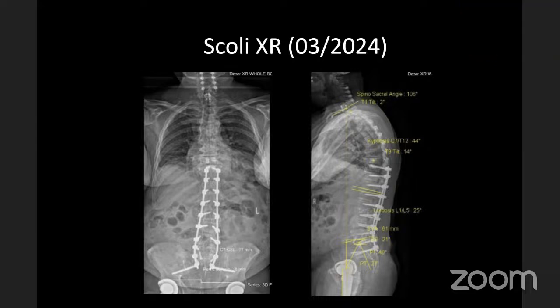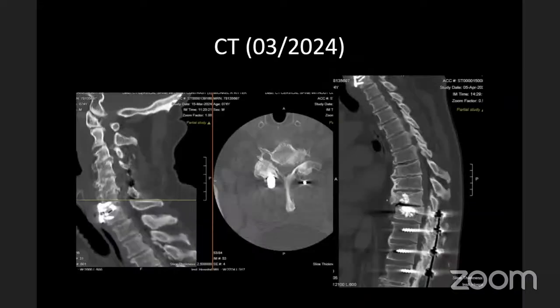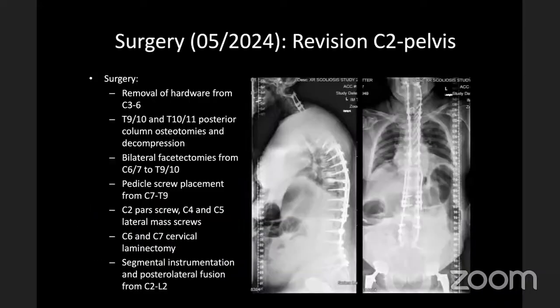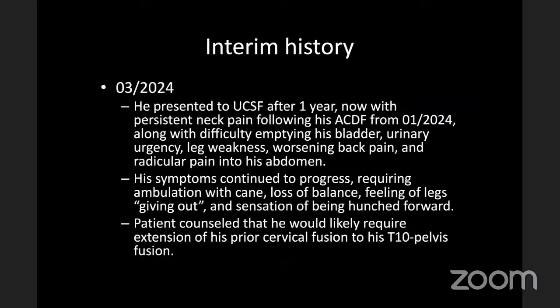Hi, this is Shane Birch. This is my case. It was a great presentation, I'll just fill in the blanks here. The reason we chose this case is the patient had done well for a few years and then developed, almost at the same time, severe cervical spinal stenosis and severe thoracolumbar spinal stenosis. So above, essentially adjacent segment disease, not really PJK. We had the conundrum of having severe subjacent cervical thoracic spinal stenosis and superjacent thoracic spinal stenosis from the prior imaging. And then it gets into the choice of how do you do this?